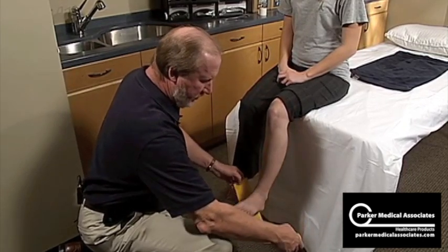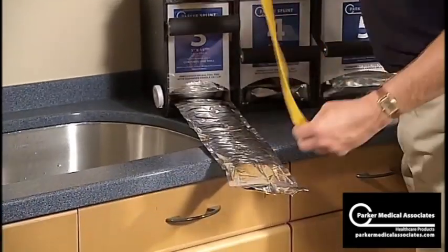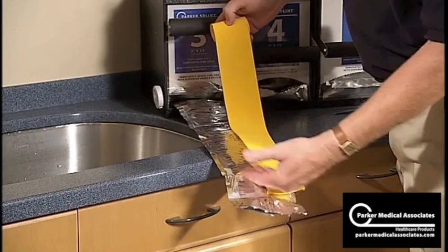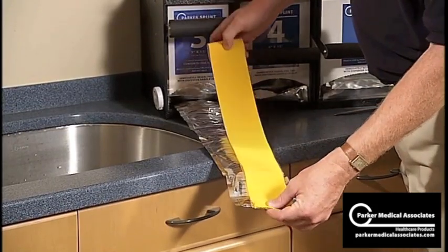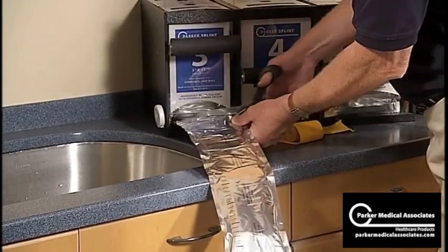I'm going to be using a three-inch on her foot. From the end of the foil — even though it's pushed back in, that's where you last cut it — so that's where you want to measure from, remember. And just cutting it right off here.